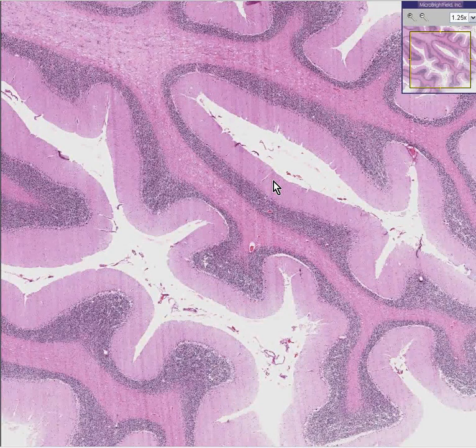I know you could instantly recognize this as being cerebellum. There's absolutely nothing else in the whole body that looks like this. This is cerebellum. If you didn't instantly recognize it as cerebellum, I guarantee you probably were struggling tremendously with the rest of these 550 videos.